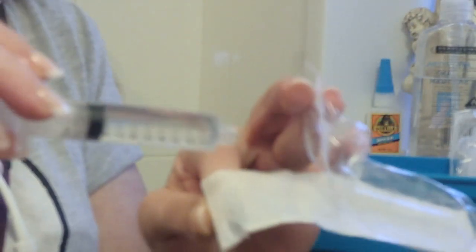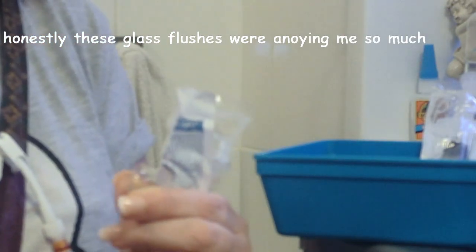Take it to the top, put that back in without it touching. Yeah, that's one. I'm not doing a cap change today. If I'm doing a cap change, I put the caps on the end, but I'm not. I draw my other one up. Got my bottle again. Very common spot. Gel my hands again.